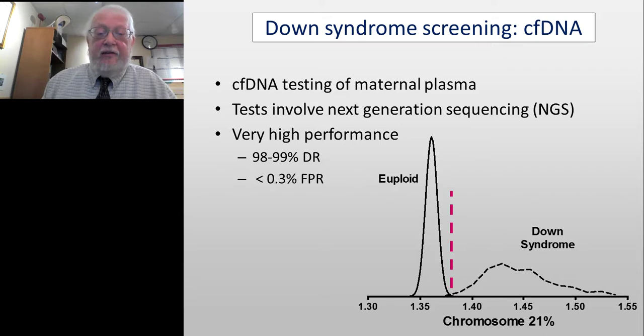So you can draw a cutoff at roughly 3 SDs. That's what this corresponds to. And if we were to zoom in here, you can see, yeah, okay, there might be a few false negatives, there might be a few false positives, but it's almost diagnostic.